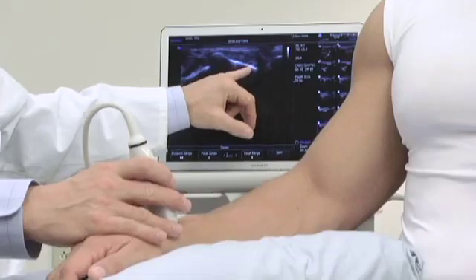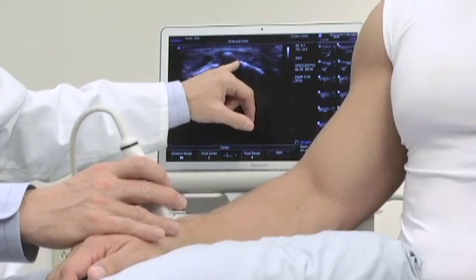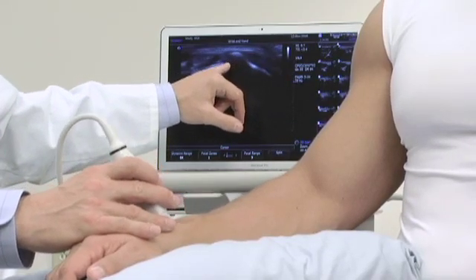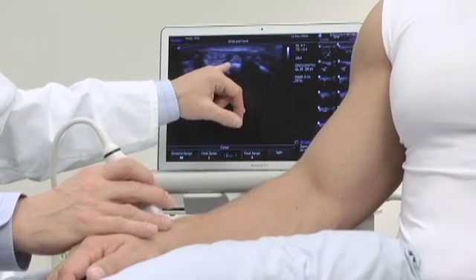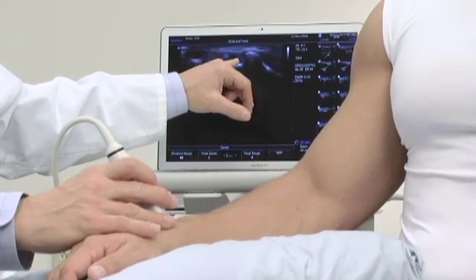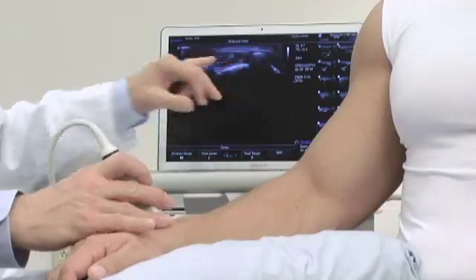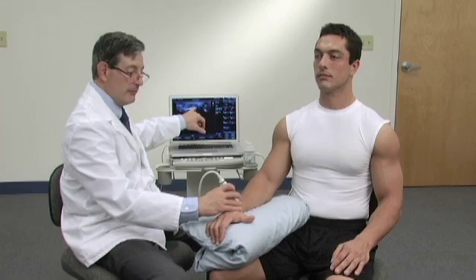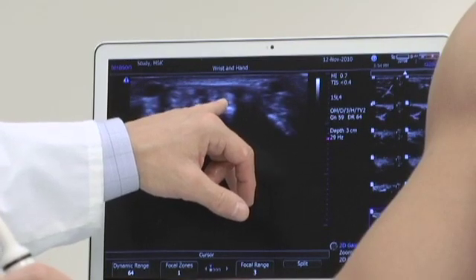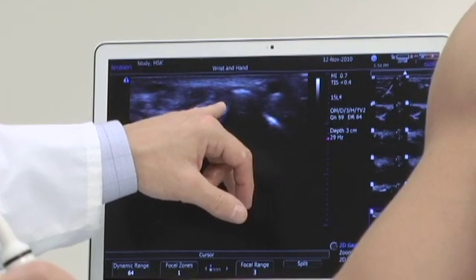The extensor carpi radialis longus, the extensor carpi radialis brevis, and next to it is Lister's tubercle. On the ulnar side of Lister's tubercle is the extensor pollicis longus. If you would extend your thumb backwards, please — we can actually see the movement in that area. And then back and forth with the thumb, please. And then relax.